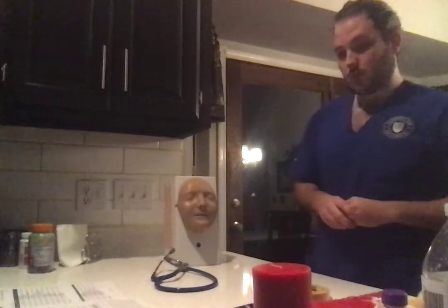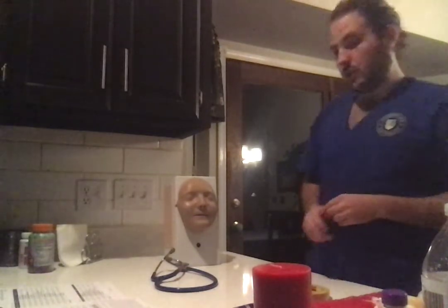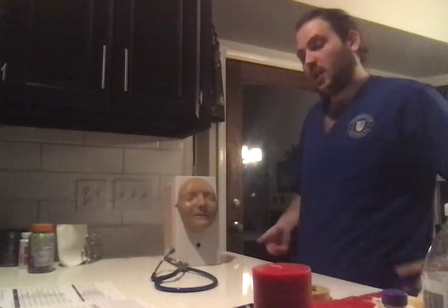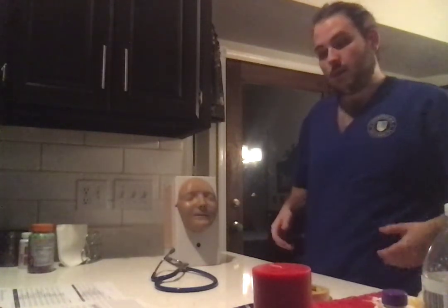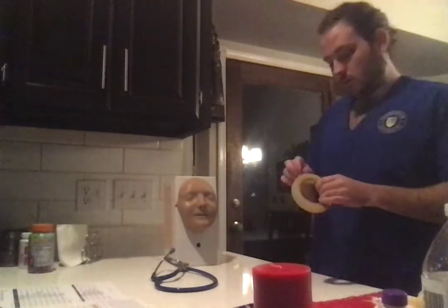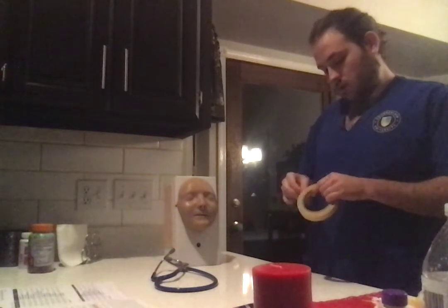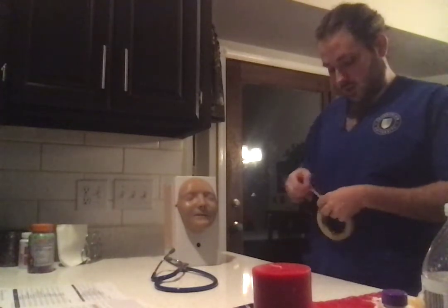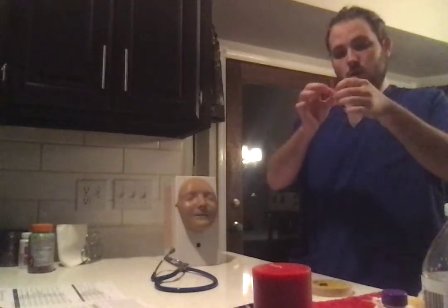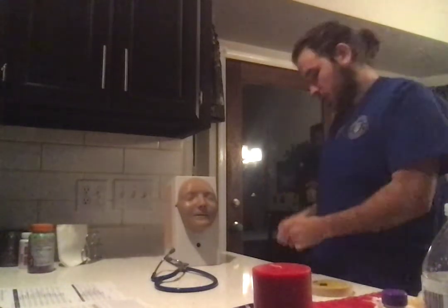Okay. We would place the patient in a high Fowler's position by raising the head of the bed up. We would raise the bed itself up to hip level. We would perform hand hygiene and then prepare our tape. Tonight I'll be using 3 pieces. One to anchor the NG itself on the patient's nose.